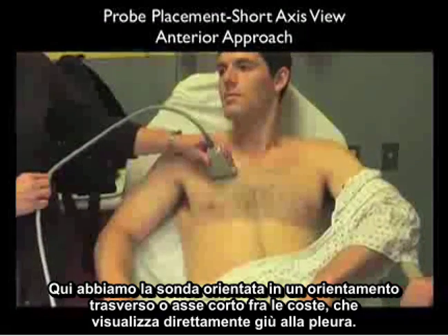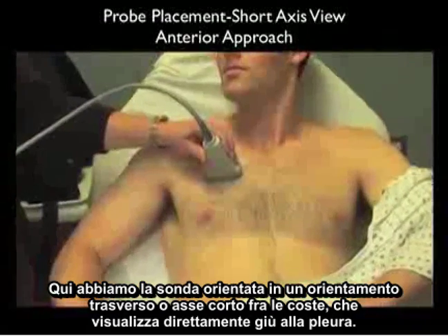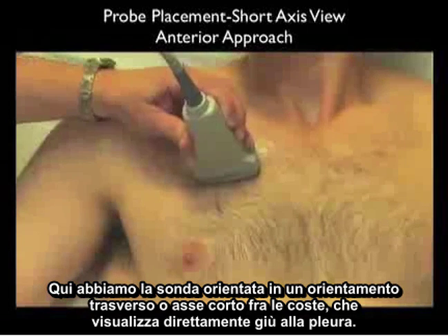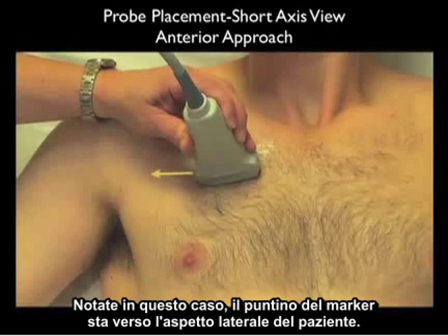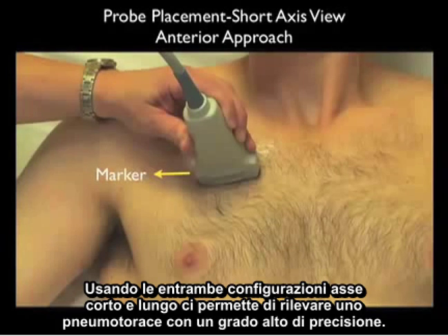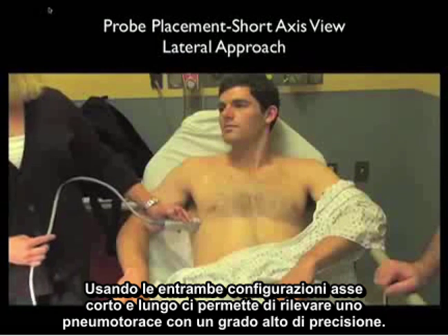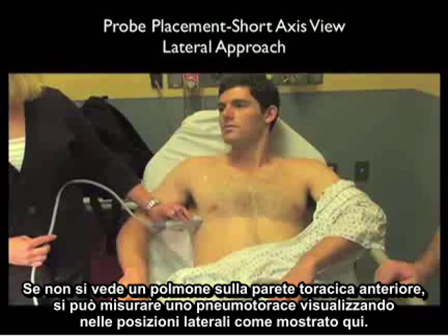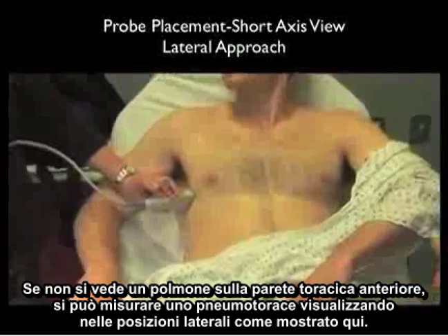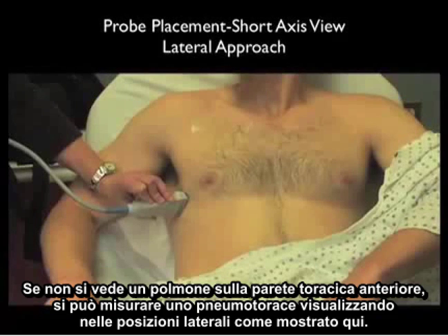Here we have the probe oriented in a transverse or short axis orientation between the ribs looking directly down at the pleura. Notice in this case the marker dot is located towards the lateral aspect of the patient. Using both long and short axis configurations will allow you to detect a pneumothorax with a high degree of accuracy. If no lung is seen on the anterior chest wall, one can size out a pneumothorax by looking in the lateral positions as shown here.